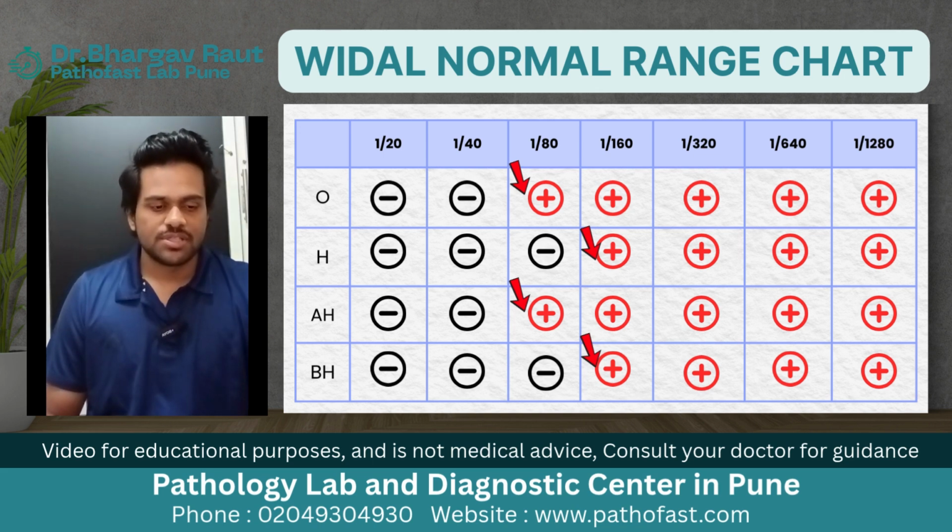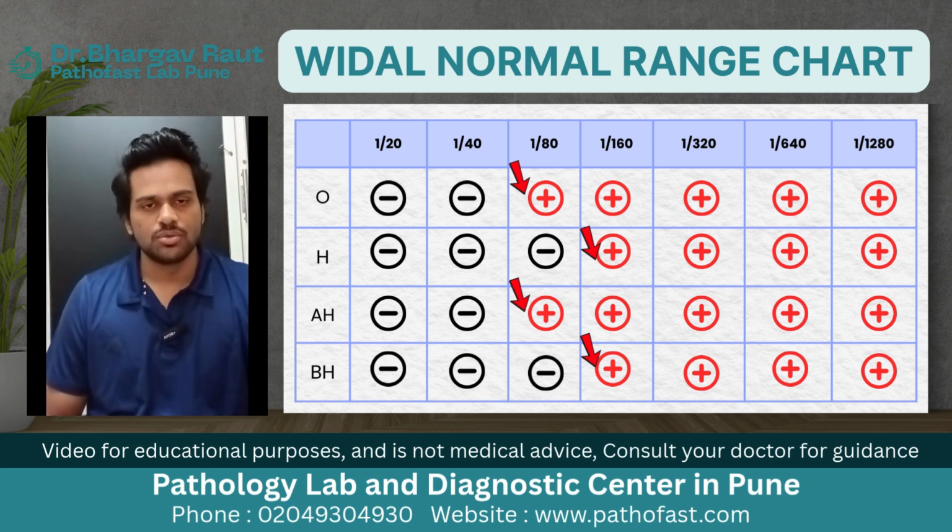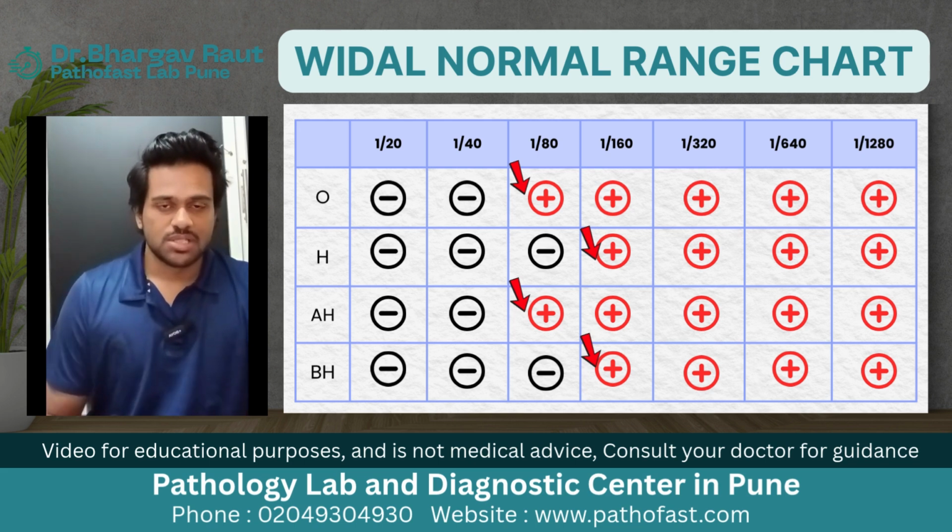The typhoid test, which is also called the Widal test in most places, is a little confusing for a lot of doctors, students, and even patients to understand what these big long charts actually mean. So, I'm going to take this one step at a time.